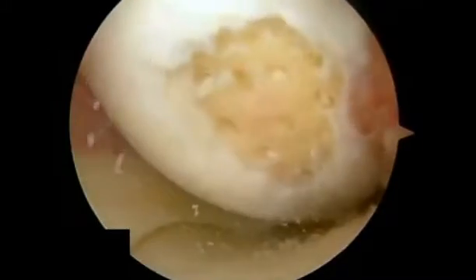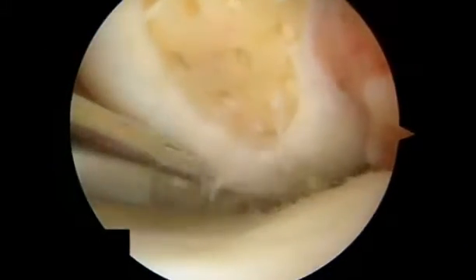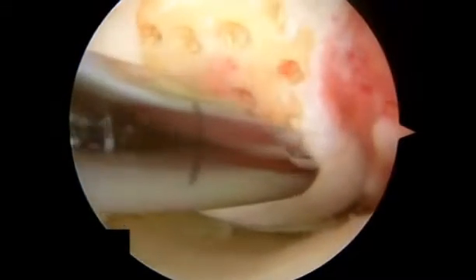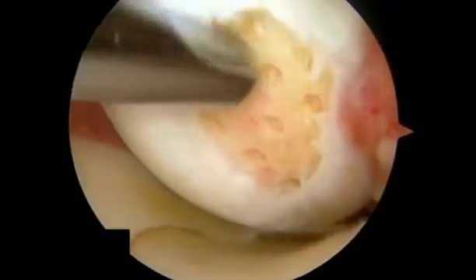These 1.5 millimeter diameter holes are placed approximately three millimeters apart and are approximately six millimeters deep depending on which power pick is used. The holes are created such that cells and growth factors from the bone marrow will elute from the holes, combine, and clot to form a covering over the repair site. The clot matures and forms a new hyaline-like cartilage that fills the chondral defect.